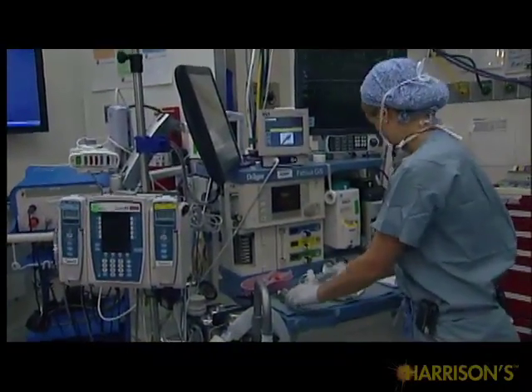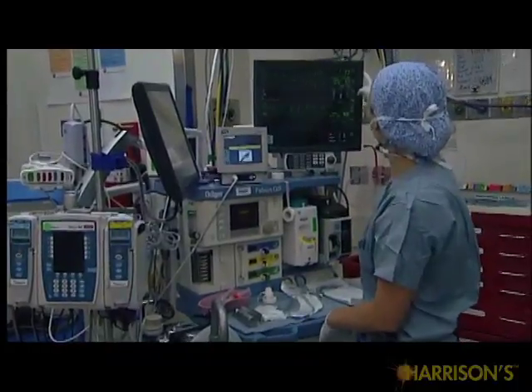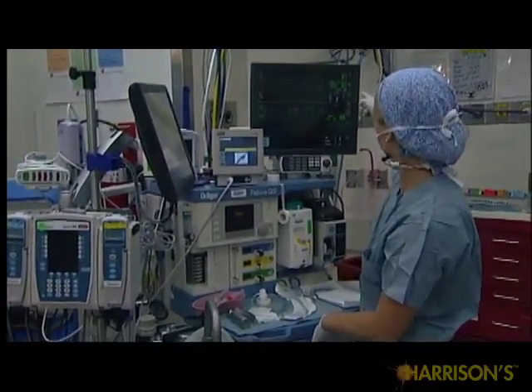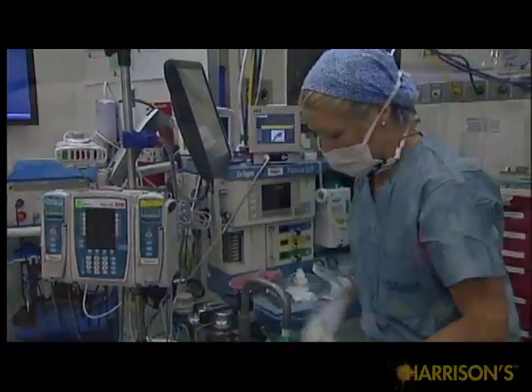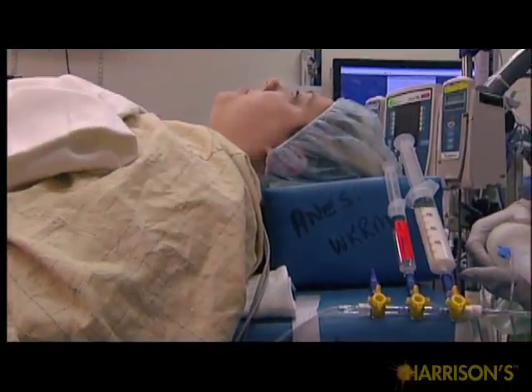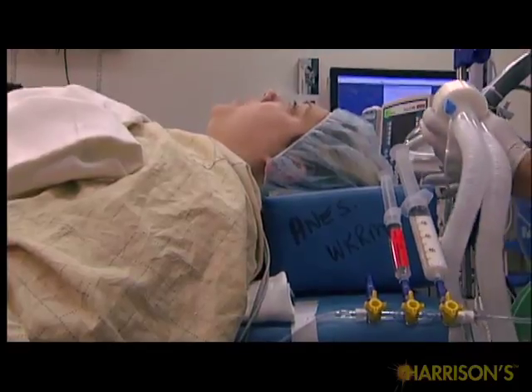Before administering medications to induce anesthesia, ensure that you have optimal intubation conditions on the first attempt at laryngoscopy. It is important to optimize patient position, check all equipment, check access, and pre-oxygenate the patient prior to inducing.